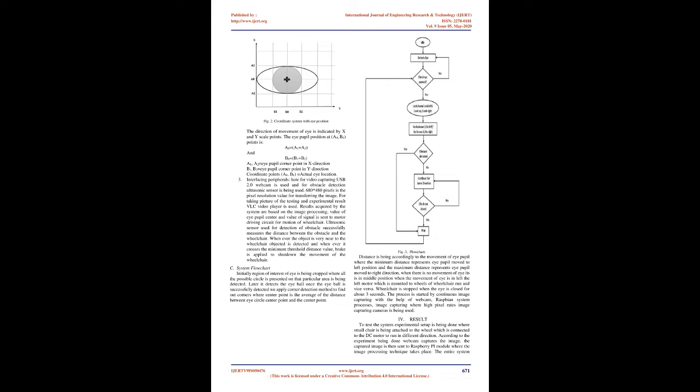13. 3. Methodology. A system overview. The basic fundamental of the proposed system is eye tracking and detection of eye movement. To detect the location of the eye pupil, the Haar cascade algorithm is used.